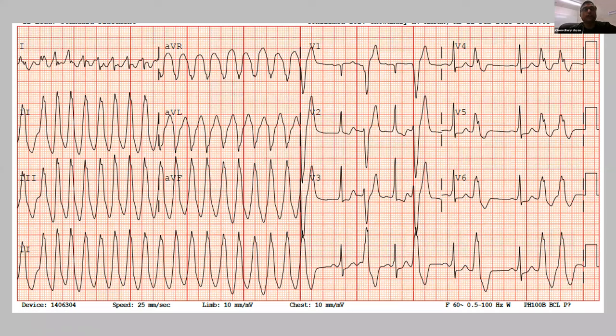If you look carefully, one of the things that happens with antidromic tachycardia with WPW is that the AFib is really faster than you usually see. It is about 190, 200, 210. With this degree of fast ventricular rate with irregularity in a young patient, it is very suggestive of underlying WPW. And in this case, pre-excitation is documented in the same setting.